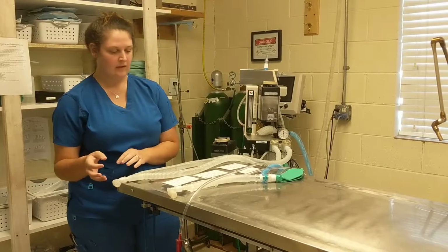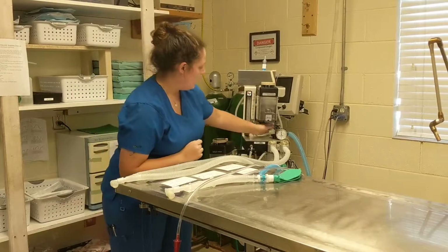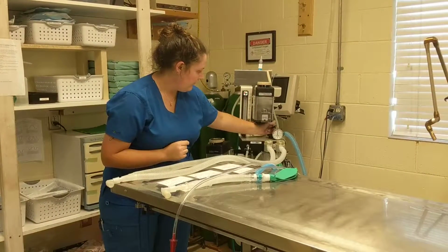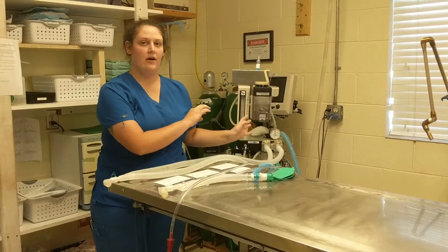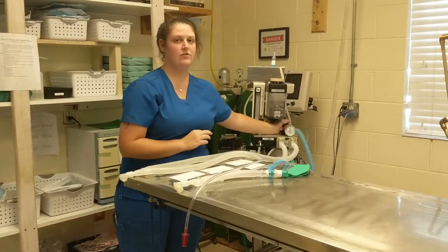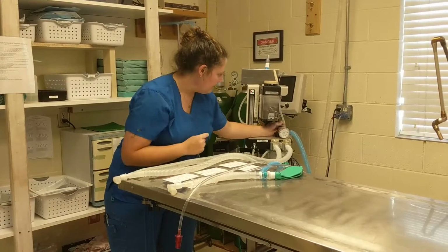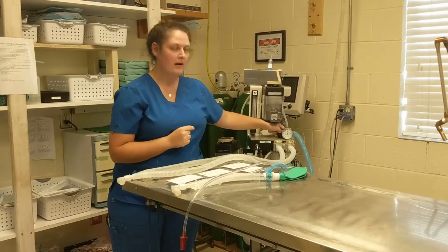and pass. In order to give a patient a proper breath, we have to use this attachment called the pop-off valve. You close the pop-off valve like so. This closes the valve off to the entire machine so that air is only going out one direction. This does not allow the patient to exhale, so we have to open back up this pop-off valve. In some equipment, there is a small button like this that allows us to close it quickly and release it quickly.